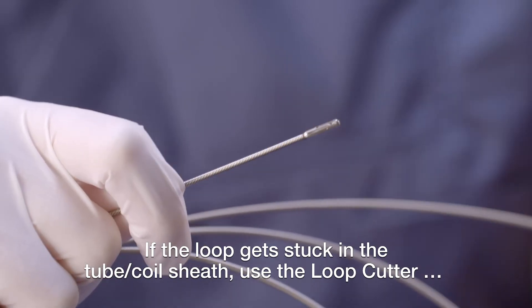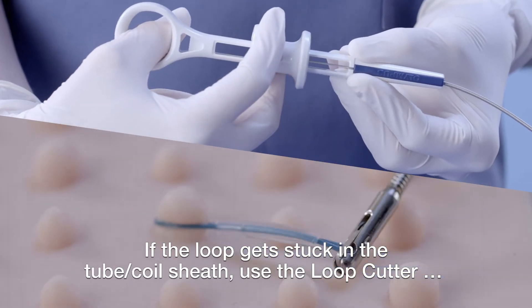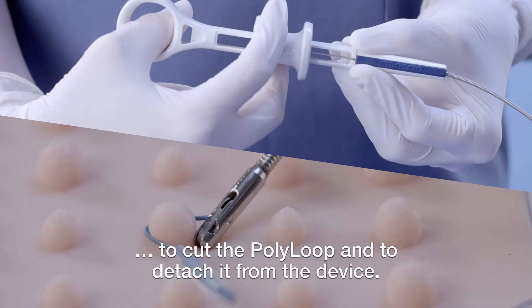If the loop gets stuck in the tube coil sheath, use the loop cutter to cut the polyloop and to detach it from the device.